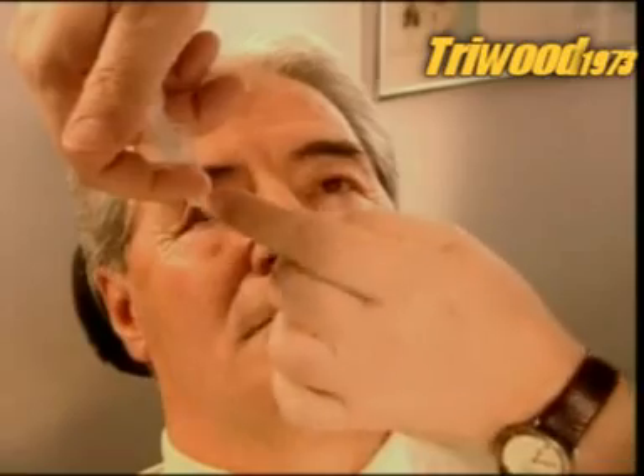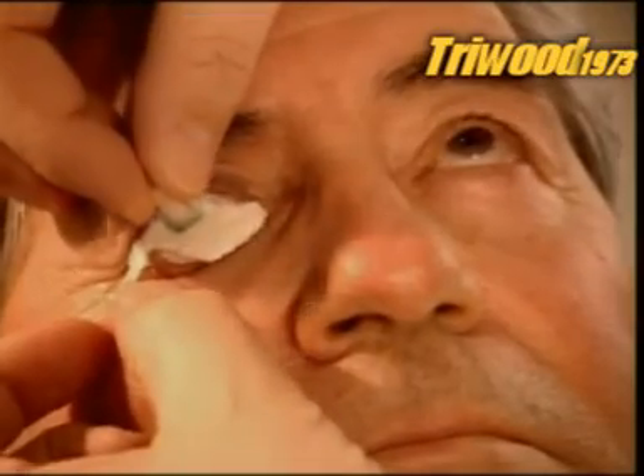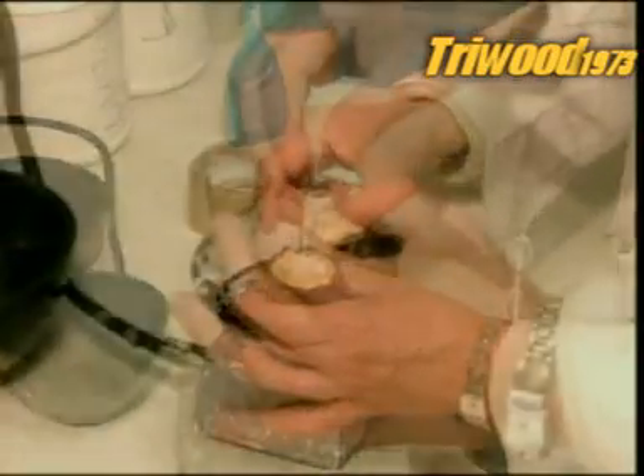After inserting an impression tray, they inject a material called alginate, filling the entire socket cavity. After 90 seconds, the alginate sets, and they can remove the hardened impression.